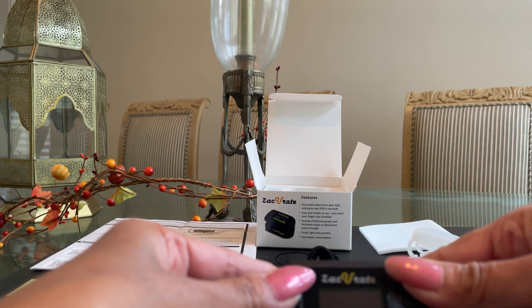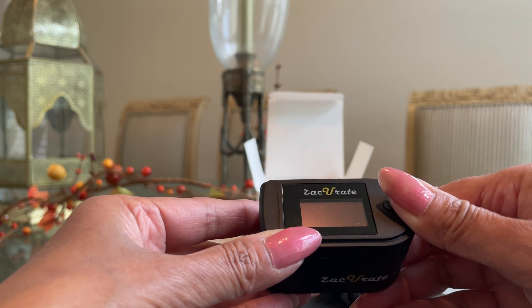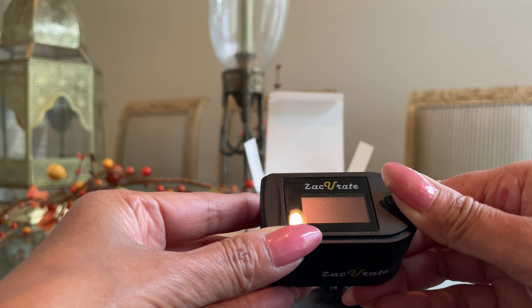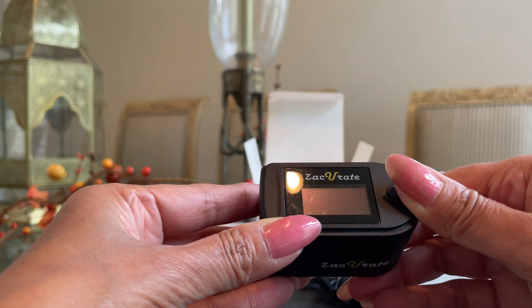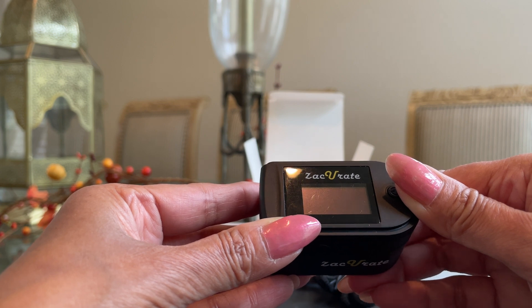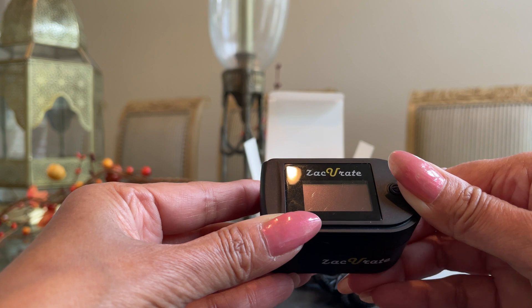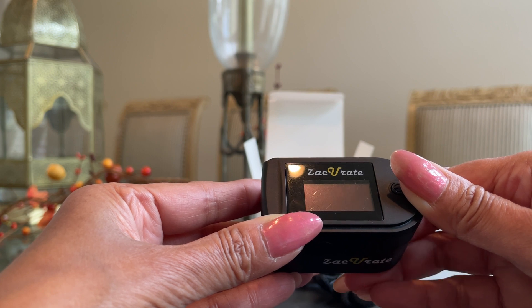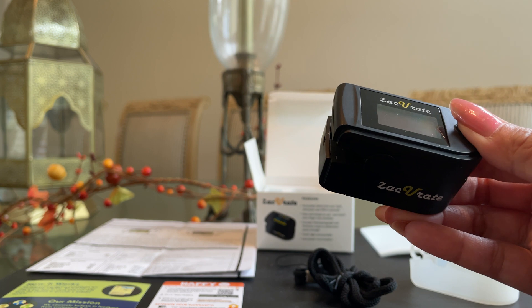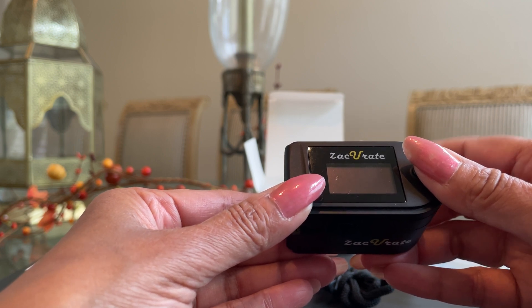What to avoid during pulse oximeter testing: number one, for all the ladies, please avoid dark nail polish. Also avoid artificial fingernails and tattoo or henna art on your fingers. And lastly, for everyone, make sure your fingers are not cold, wet, or sweaty. If you do have cold fingers due to weather or poor perfusion, warm your finger prior to checking the result. There are several things to avoid to get reliable and accurate results.